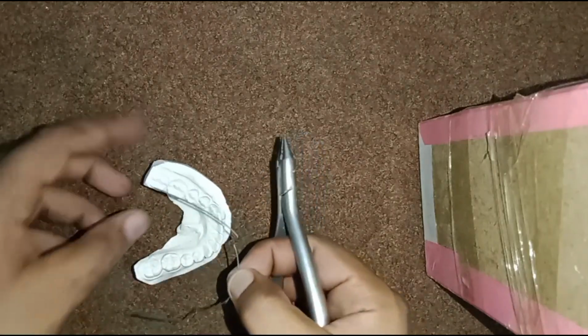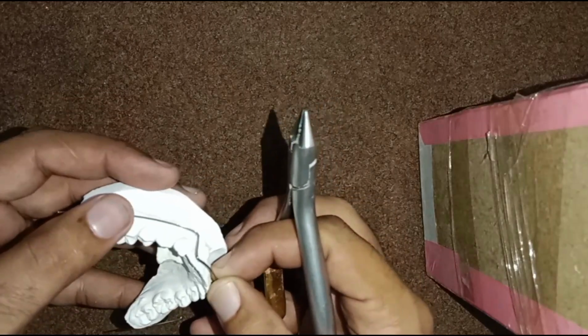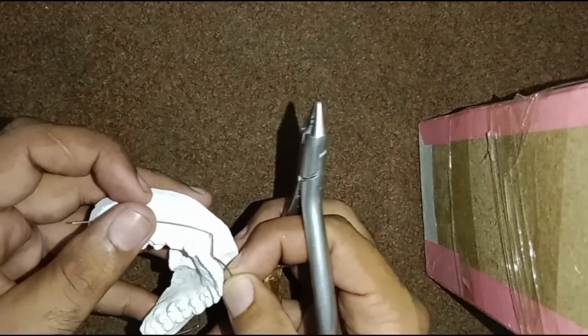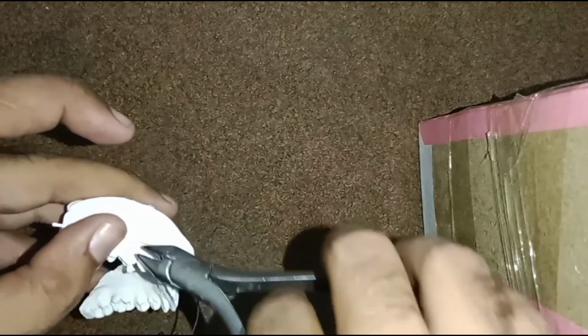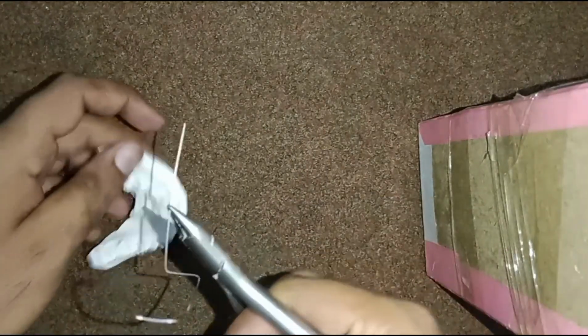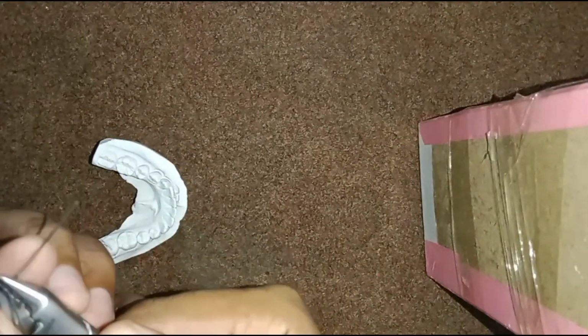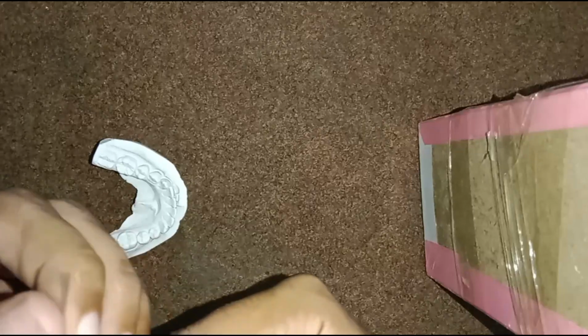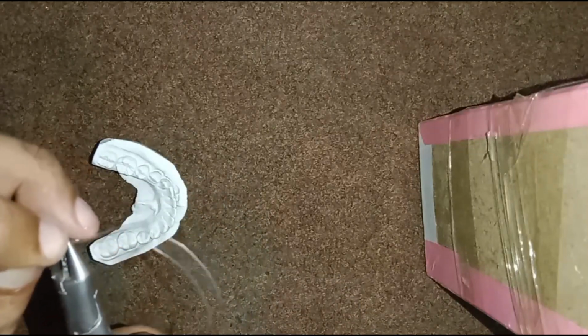Then we will measure on the cast, place a mark mesial to the molar and hold the wire at that mark. Mesial to the molar, we will bring it upward with a bend of 90 degrees. Then we will place a bend of 3 to 4 mm.